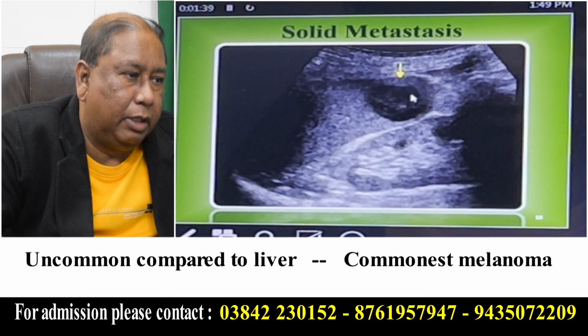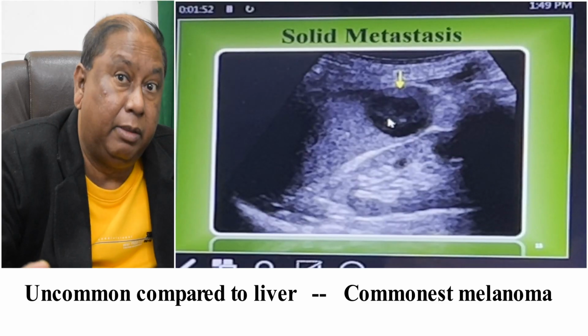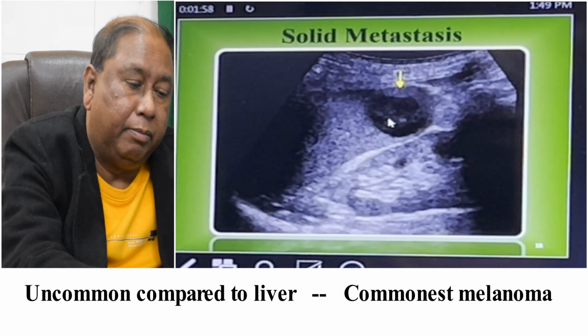See what you can see in this picture. It is a metastasis. It is a solid metastasis. And this is uncommon compared with the liver. And the commonest is the melanoma.